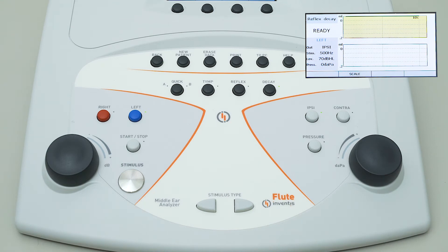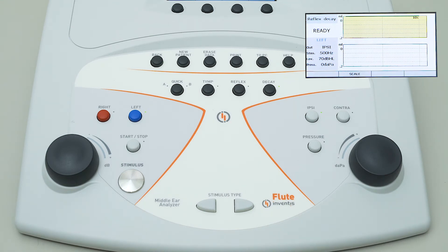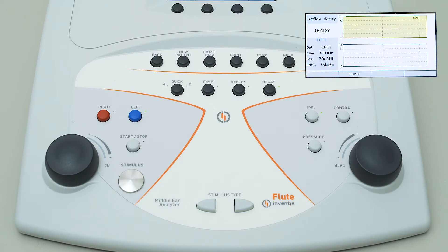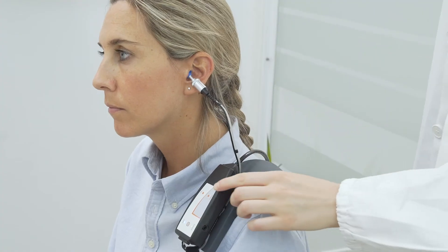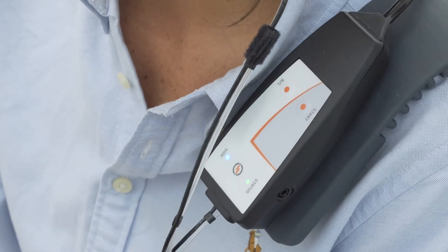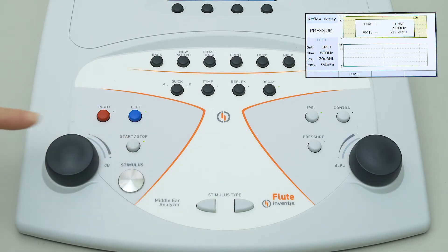Before starting the exam, set the stimulus activation time to be 10 or 20 seconds from the settings window. Then introduce the probe into the patient's ear canal and start the exam by simply pressing the start button on the keyboard or on the control box.